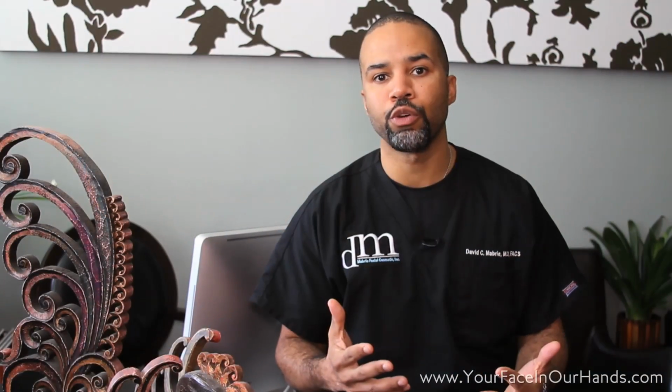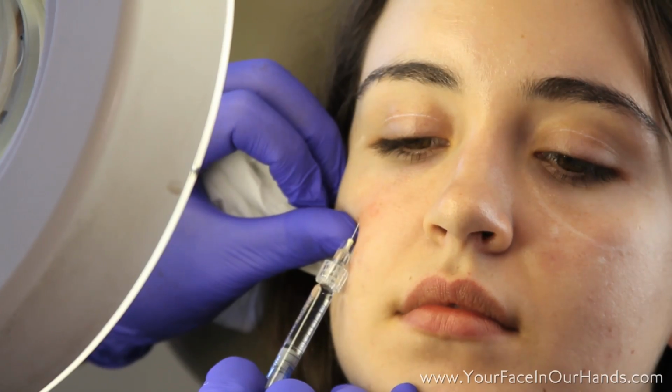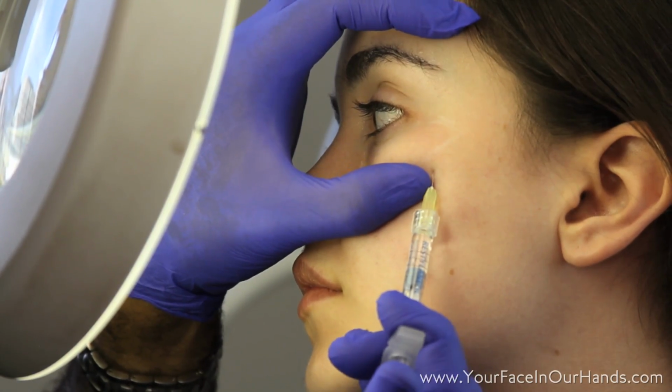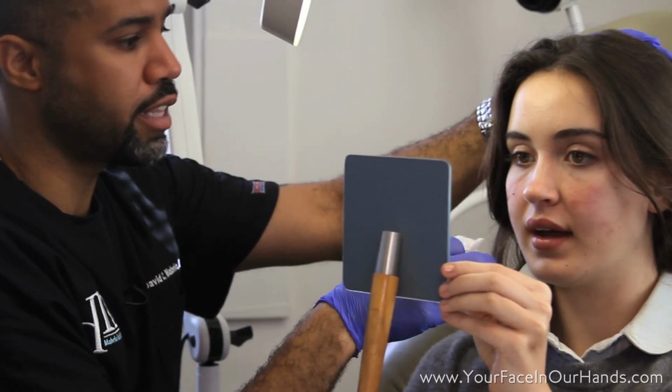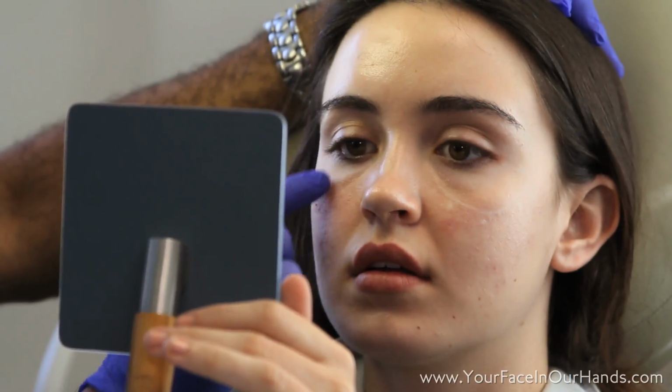And hopefully I've shown that when we're treating the under eye area with fillers, we are actually treating those two areas together, the tear trough and the cheek area. And what we're actually doing is contouring the face in an effort to make it look more youthful and more attractive. I hope the video was helpful, and thank you for your attention.